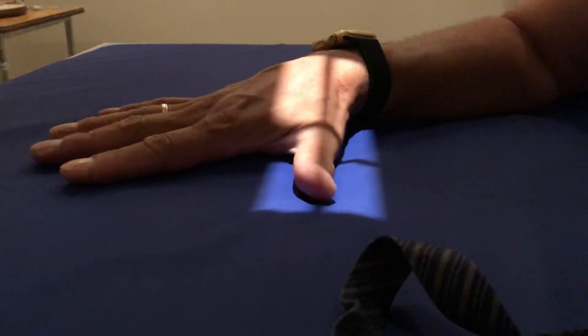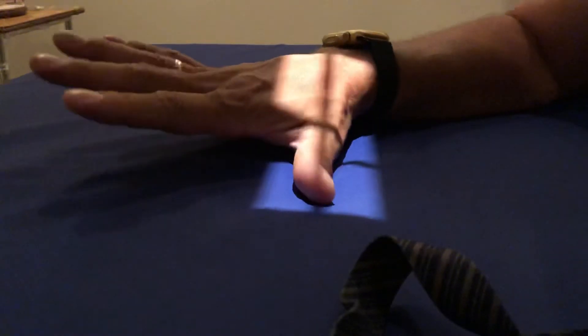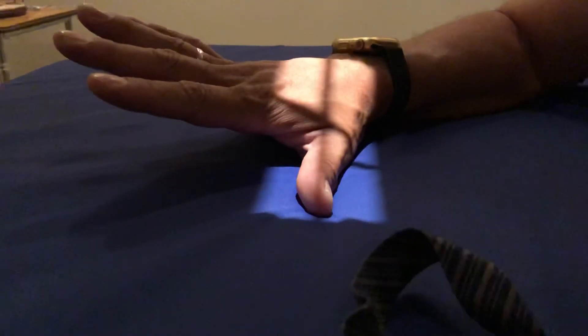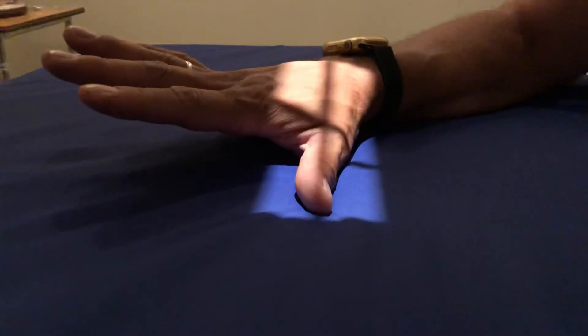Second one, you can have the patient lift their fingers up, and by doing that, it turns it into a lateral view, and you take the exposure there.